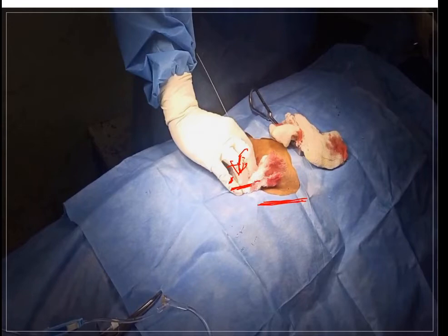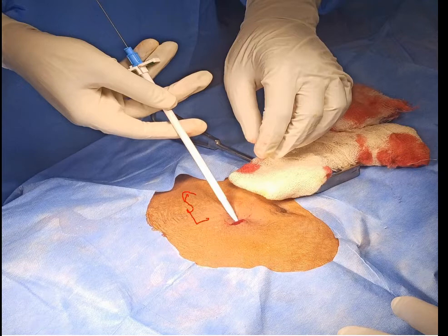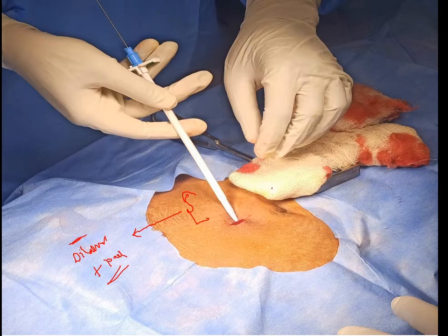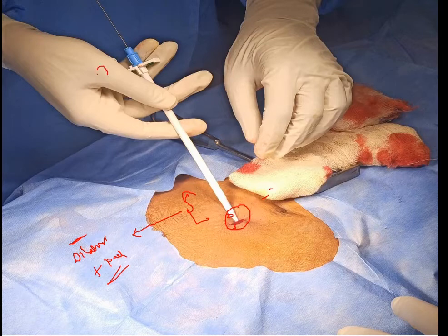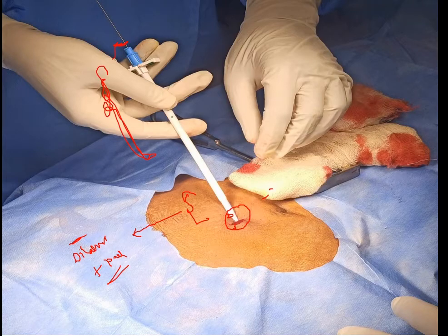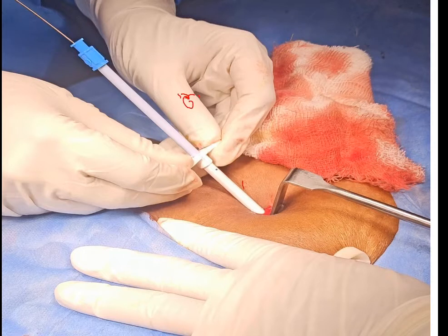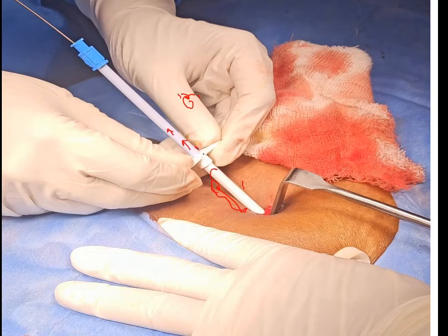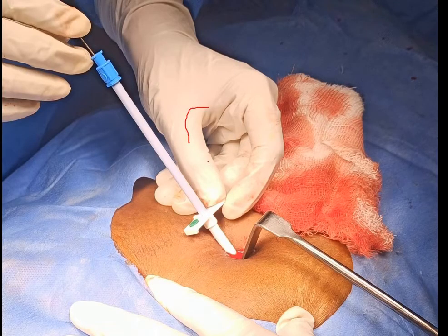The next step is insertion of the dilator along with the peel-off sheath. This dilator-cum-peel-off sheath is available in the PD catheter set. We insert it over the guide wire until it reaches the rectus sheath, similar to the permcath peel-off sheath — except here there is only one dilator-cum-peel-off sheath. We remove the cannula and insert this over the guide wire. Once half of the dilator is inside and the peel-off sheath is advanced, we start removing the dilator while pushing the sheath fully in.